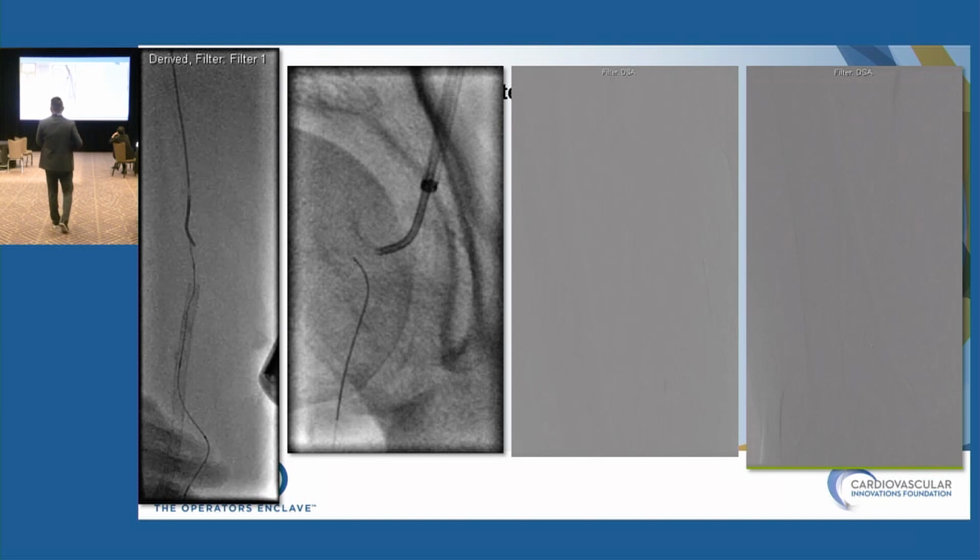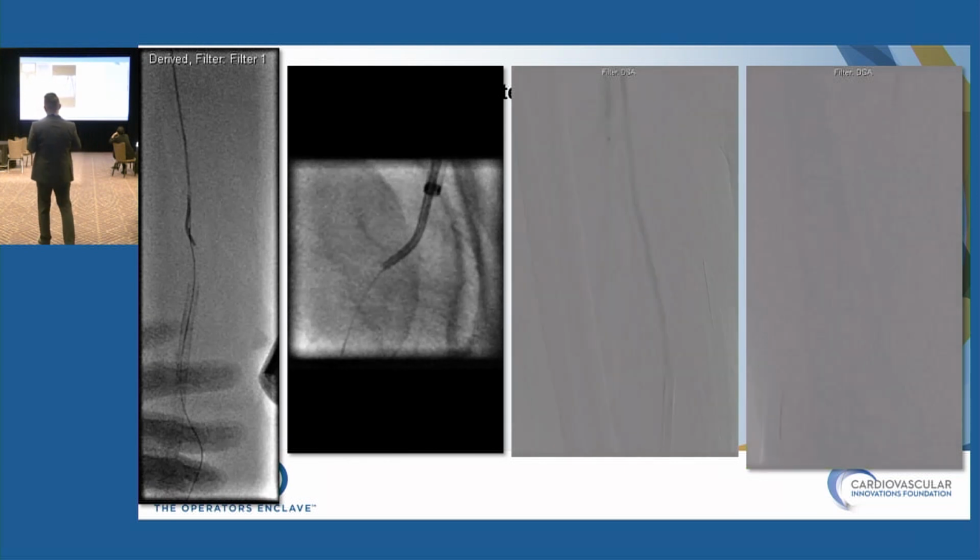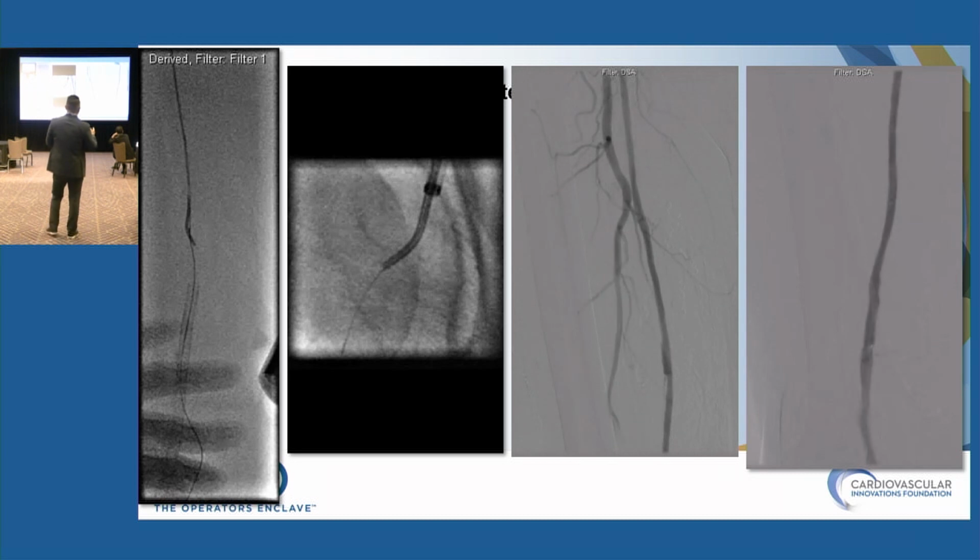Here you can see I take a CXI 018, so I didn't put a sheath in. You can, but I just follow with a CXI. Put the wire into the vertebral catheter at the common femoral, exteriorize it, reverse everything, come down, balloon, and put stents in. And so again, nice result without having access to a tibial vessel.